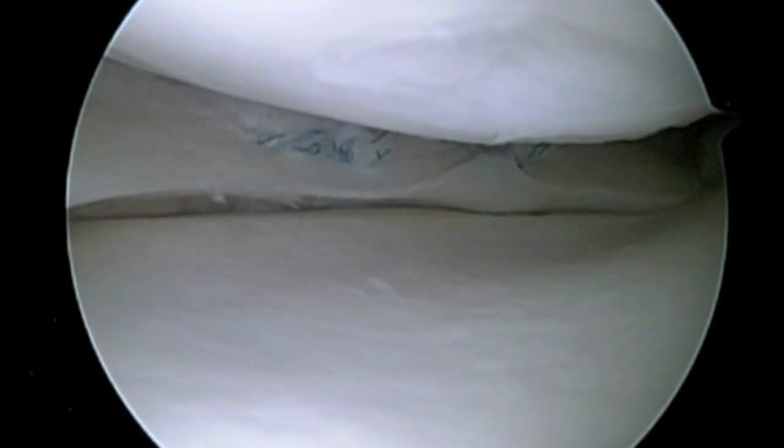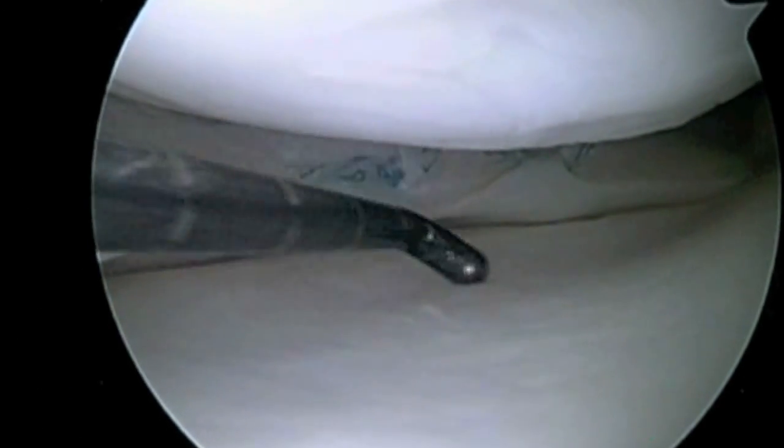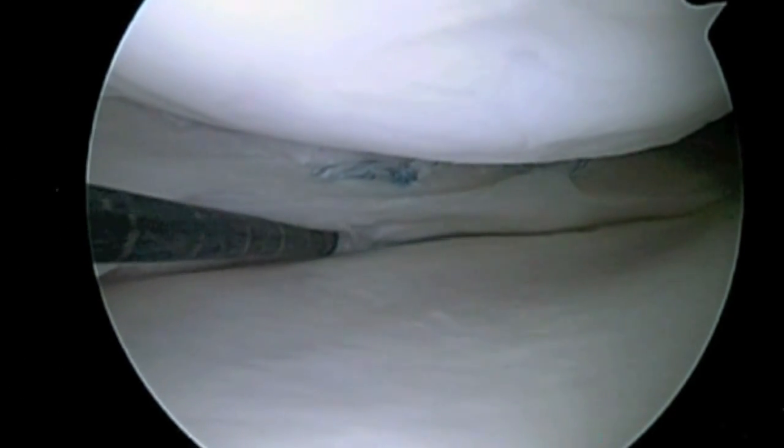The suture is cut short and the meniscus repair is completed. We then check the repair for stability with this probe and find that it has very good stability.